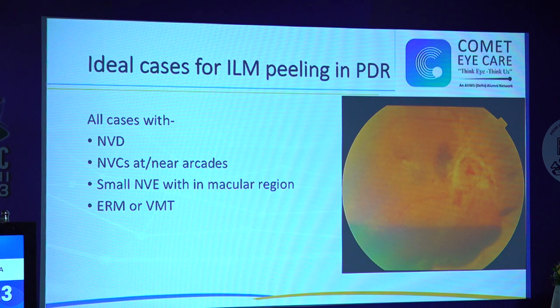So what are the ideal cases of ILM peeling in PDR? As per our observation, we advocate all cases with NVD or NVCs within the arcades or near the arcades, and cases with ERMs or VMT. All these cases have high chances of recurrent ERMs. So preferably we should do ILM peeling in these cases.